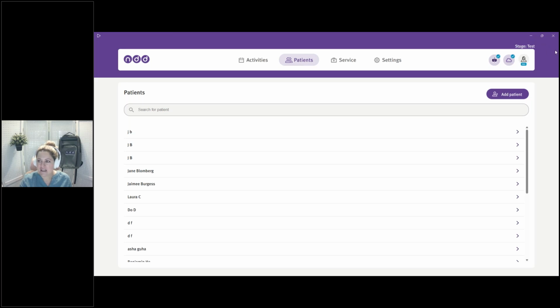That is kind of the end of the demonstration here. Let me go ahead and stop sharing that screen for just a moment. I'm going to open up the questions bar and just see if anyone has had any questions pop up.